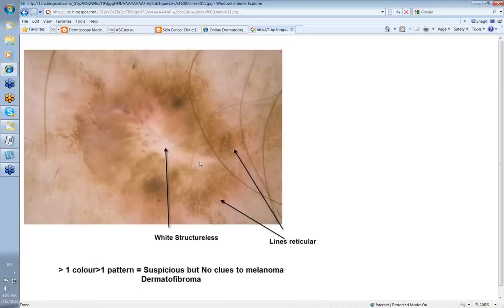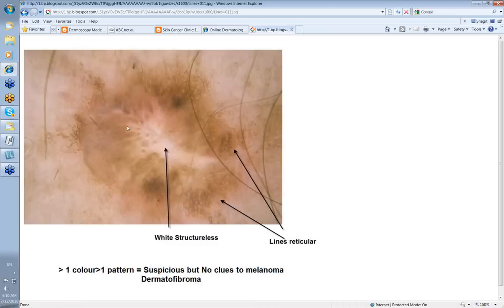There can be other non-melanocytic lesions that can look dark like a melanoma — and this is one: a dermatofibroma. It can have lines reticular around the outside, because there's irritation of the melanocytes in the overlying epidermis, causing them to produce more melanin, giving this lines reticular pattern. Of course you've got a white central structureless pattern that's typical of the fibrosis of a dermatofibroma. So more than one color and pattern — suspicious — but no clues for melanoma. This was a dermatofibroma.